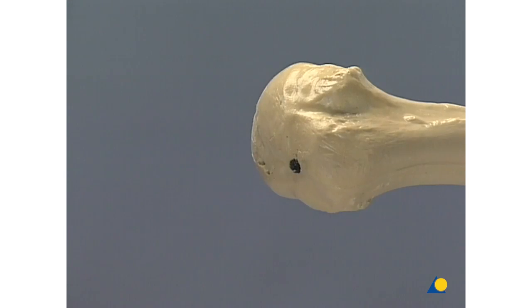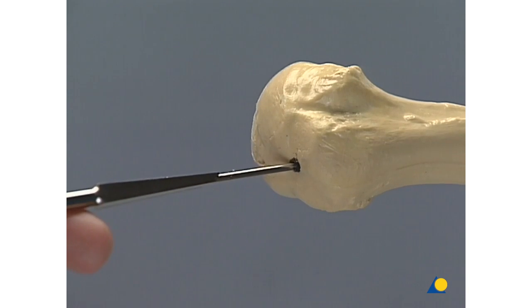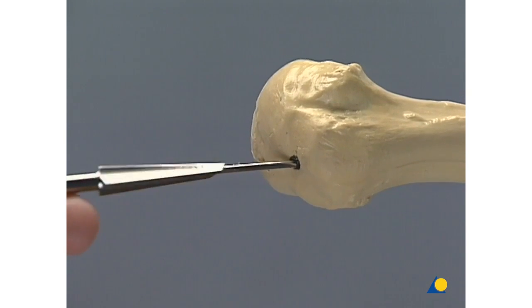The entry point must be in line with the medullary canal. This is usually midway between the margin of the articular cartilage and the medial aspect of the greater tuberosity. Using the cannulated awl, we insert the Kirschner wire into the medullary canal.